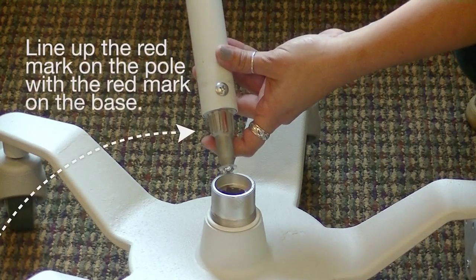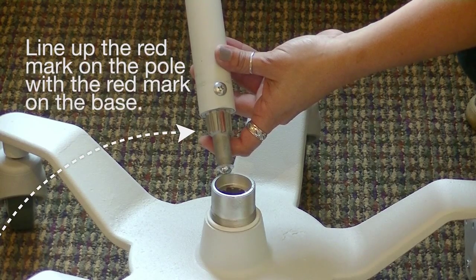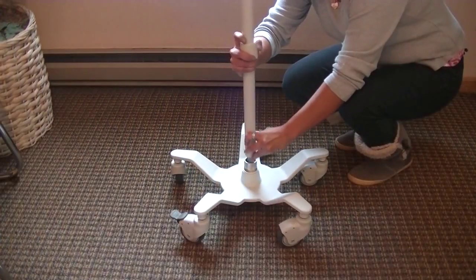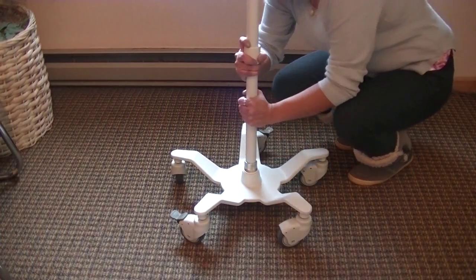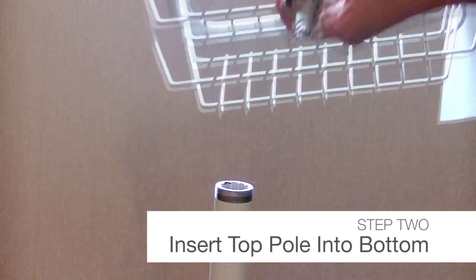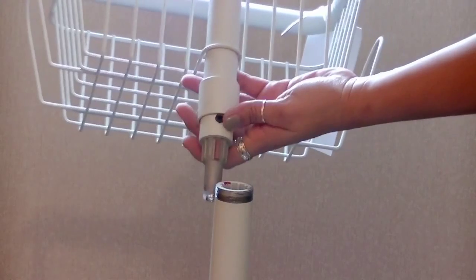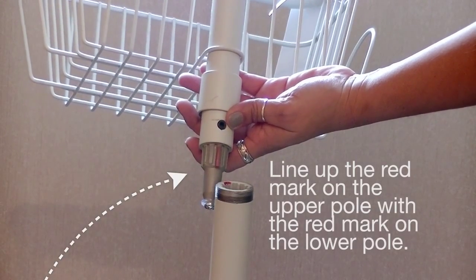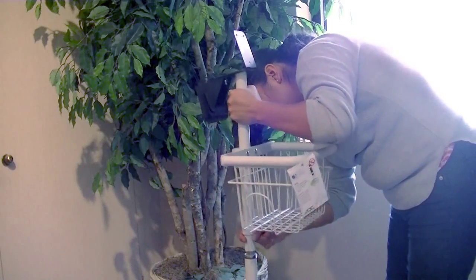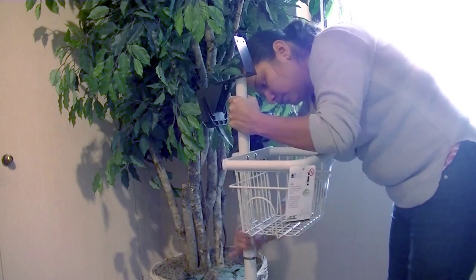To begin, place the caster base on the ground. Align the red keyway on the lower pole with the red keyway on the base. Insert the pole into the base. Twist the lock sleeve to secure the pole in place, then tighten. Follow the same method for the upper pole and basket. Align the keyway on the upper and lower poles. Insert the pole and tighten the lock sleeve until secure.